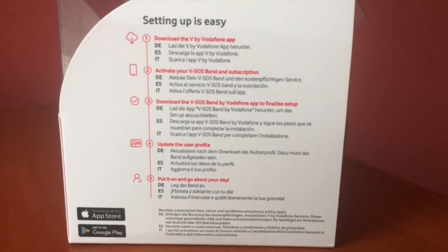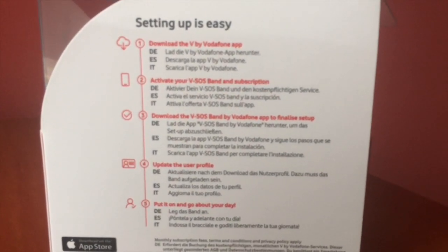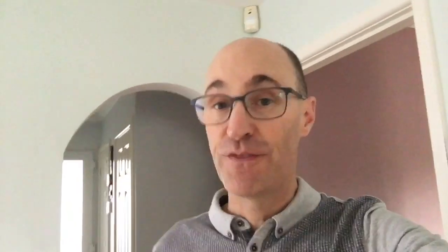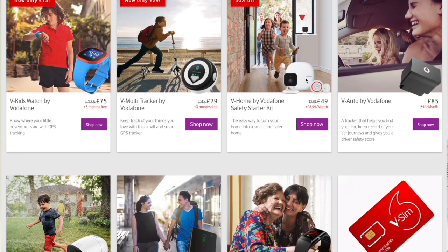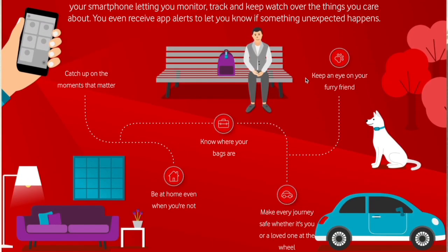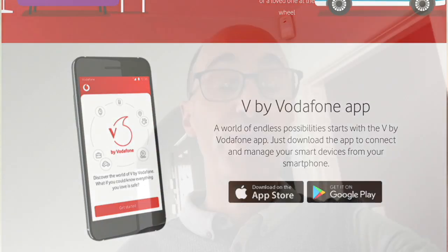It says on the box: download the V by Vodafone app, activate your V SOS Band and subscription, download the V SOS Band by Vodafone app to finalize setup, update your user profile, put it on and away you go. It sounds straightforward, but it's been a monumental pain, because there are two apps you have to run. One is the V by Vodafone app — fair enough, they do lots of different products in the V range, so there's one master app where you set up different products you may buy. Then the V SOS app is separate, so other people in your family can download just the SOS app and receive messages if an elderly relative were to fall or press the SOS emergency button.